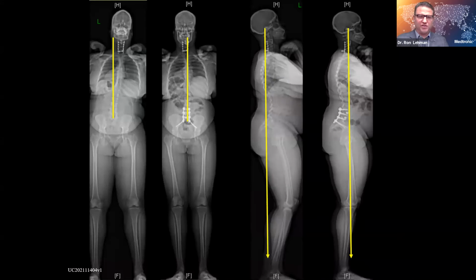So in these type of situations, with robotic assistance, we do a L4 to the ilium, decompression at 4-5, 5-1, and then 20 degree lordotic implants at 4-5 and 5-1, and adding the S2AI screws to help with additional fixation. One, because she had a kyphotic segment to start out, and two is that her BMI is a little bit higher, and so she's going to require more in terms of mechanical stability.